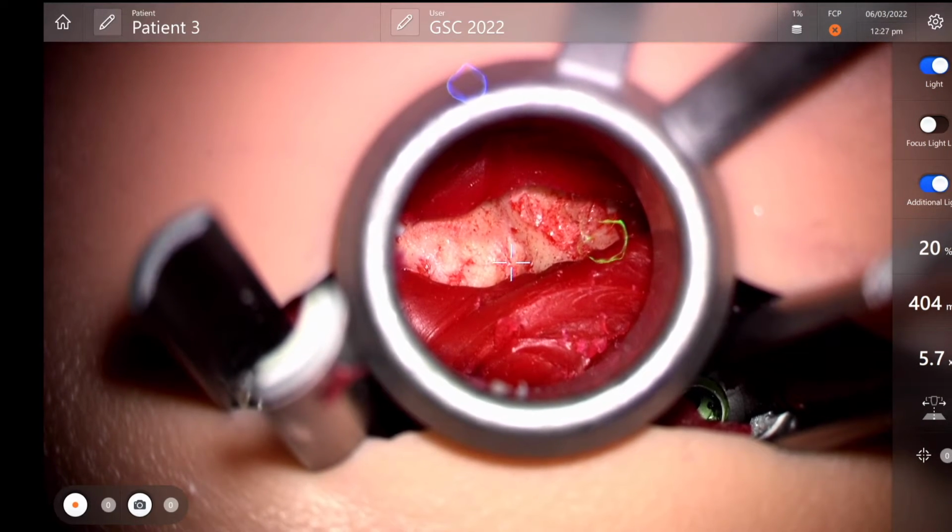Do we have a spine model here? We don't have a spine model, right? So the first part of the TLIF procedure then, in terms of the facetectomy, the way I do it, again, there are a million different ways of doing it, but the way I like to do it, I like to identify the medial inferior border of the ipsilateral lamina and the pars, and then either with an osteotome or with a drill, you connect those two structures, and that will then allow you to remove the inferior articulating process of L4 in this case, and that opens up the facet joint.